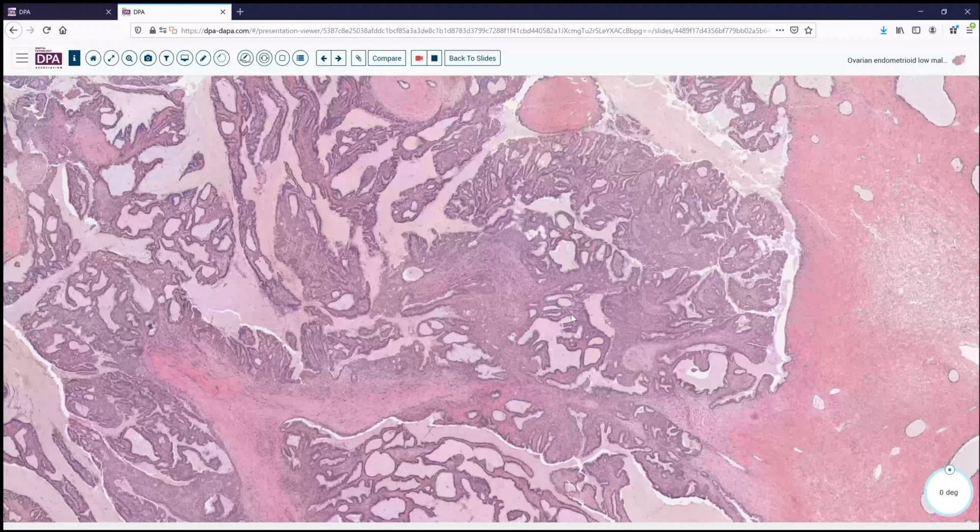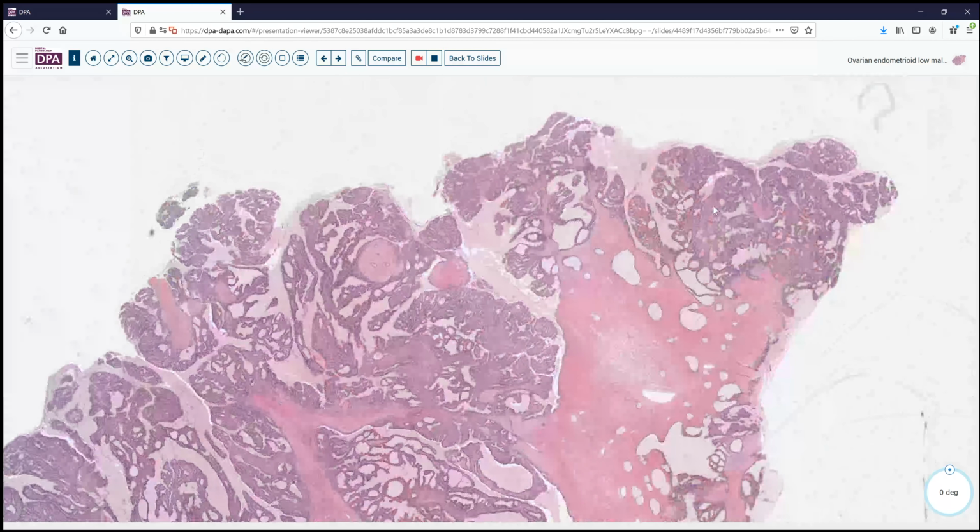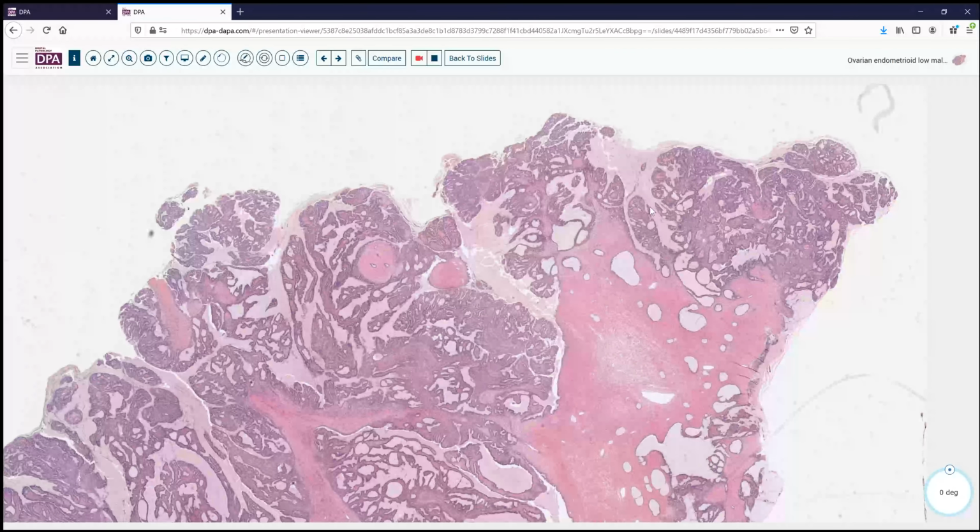And again, why is this not endometriosis with atypical hyperplasia and squamous metaplasia? Well, because it's occurring in this fibromatous background of randomly scattered tissue fragments. It's not an endometriotic cyst that has developed atypical hyperplasia.